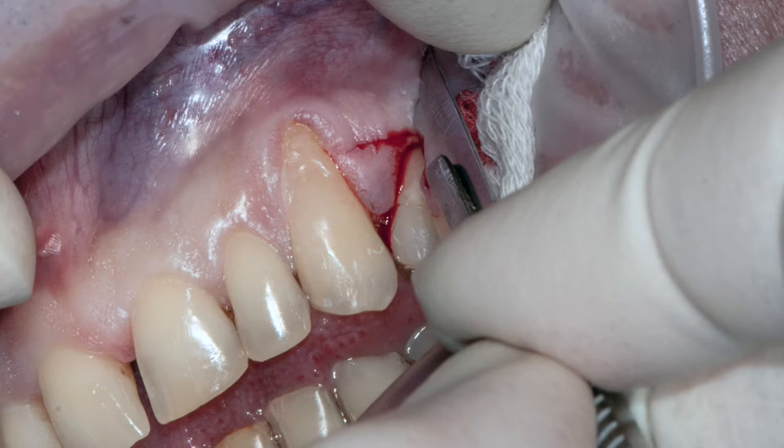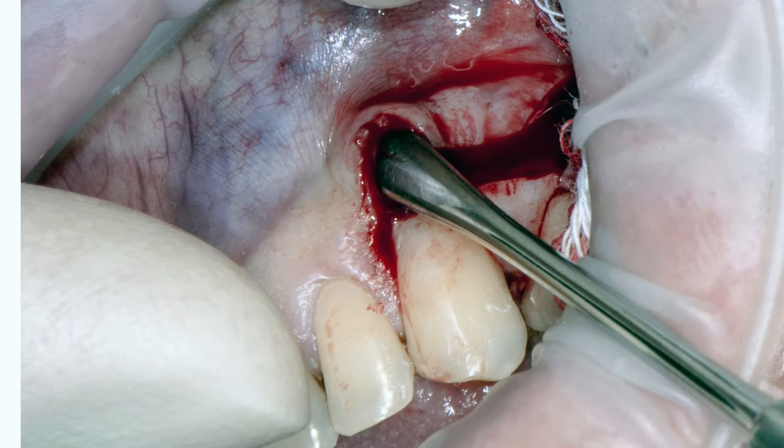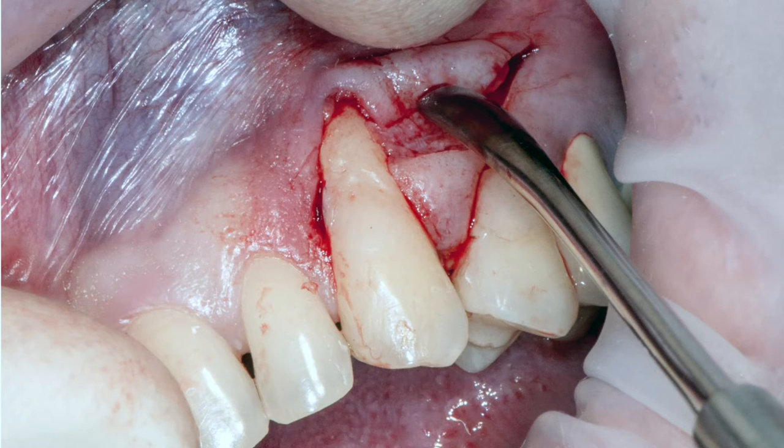Снимаются только маргинальные эпителии. Скальпель устанавливается перпендикулярно поверхности зуба, для того чтобы снять только эпителий. Затем формируется второй вертикальный разрез, таким образом этот лоскут отслаивается и мобилизируется. Мобилизация проводится так же, как при корональном смещении — расщеплением в области слизистой.